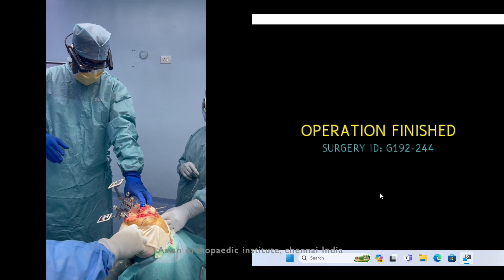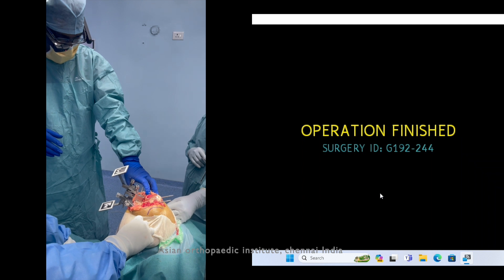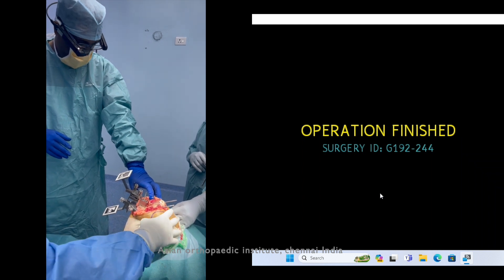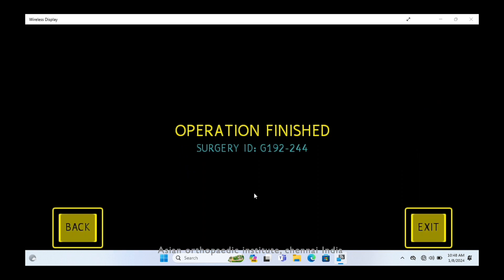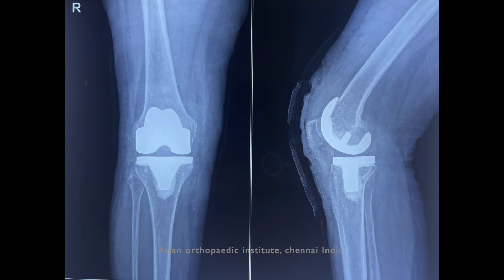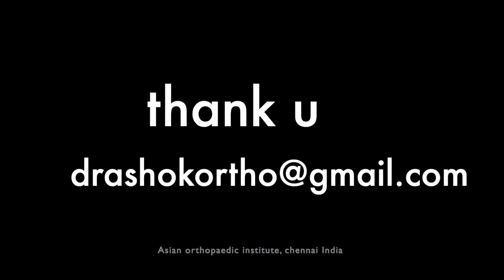You can see how I'm stabilizing it here, getting confirmation in real time. See the post-op X-ray and the post-op scanogram — how perfectly augmented reality can restore alignment. Thank you.